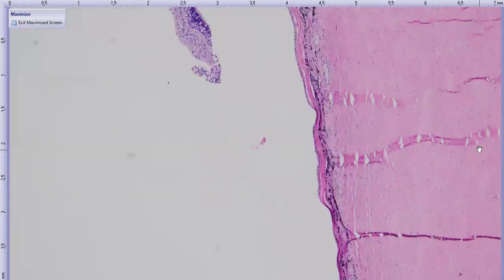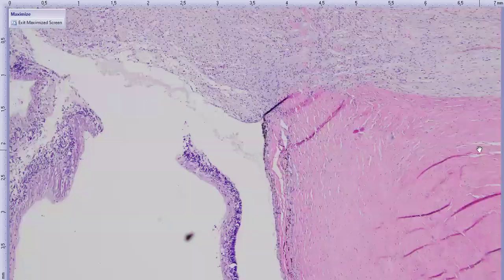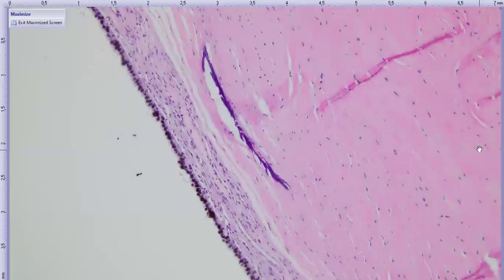And then the last thing that's kind of cute to show since we have a minute. Wait for it. Maybe the other side is better. There we go. This is totally not important, but I'll show it to you anyway so that you know that it exists, especially if you're reading horse globes in the future. So here's the choroid, here's the RPE, and then in the sclera, just posterior to the choroid, typically inner sclera, in the posterior sclera, we see these multifocal areas of mineralization.